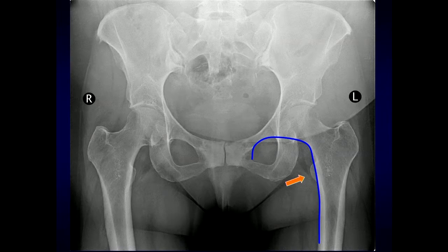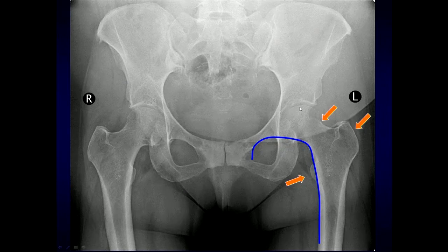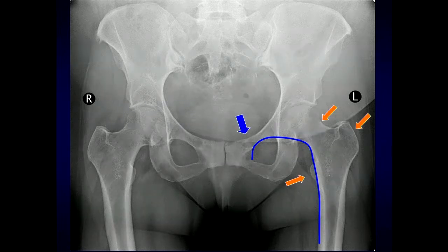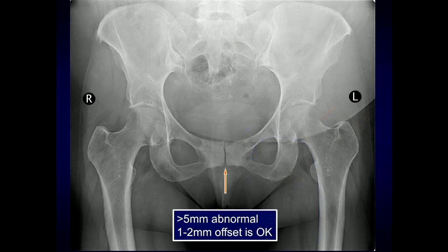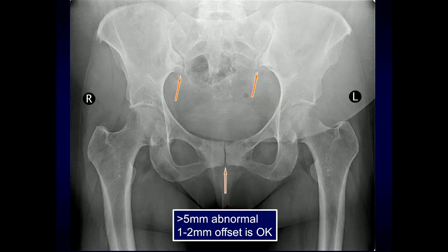You want to look at the lesser trochanter and the greater trochanter, which helps you to find intertrochanteric fractures, as well as draw a line around the femoral head and along the femoral neck to assess for fractures in this region. Additionally, take a close look at the superior as well as the inferior pubic rami. The pubic symphysis can have up to 1-2 mm of offset and that is okay; if it's greater than 5 mm wide, that's abnormal. You can also look at the congruity of the sacroiliac joints, comparing right to left, looking for any widening.